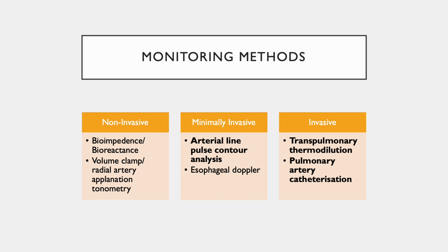So these are some of the monitoring devices that will be discussed today, classified based on the degrees of invasiveness. The bolded modalities are those that we'll be focusing on because of their availability of use as well as the robustness of evidence in a critically ill patient context. Some of the non-invasive modalities will be briefly discussed just for completeness of today's discussion.